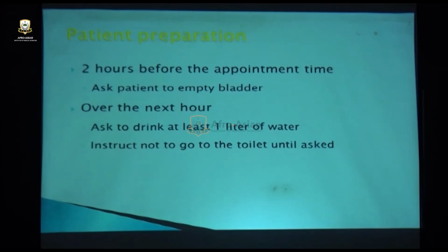So ask the patient to empty the bladder 2 hours before, and then 1 hour before drink 1 liter of water, and by the time your scan time starts, she will have adequate amount of urine in the bladder. Because if it's too little in it, problem. Too much in it, problem.